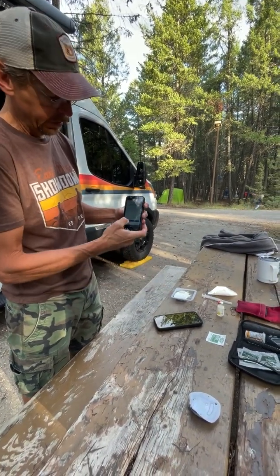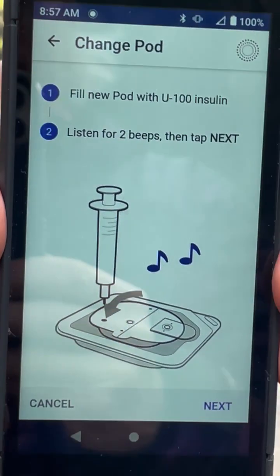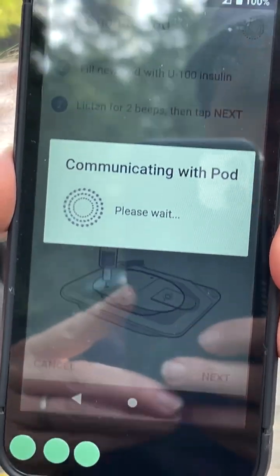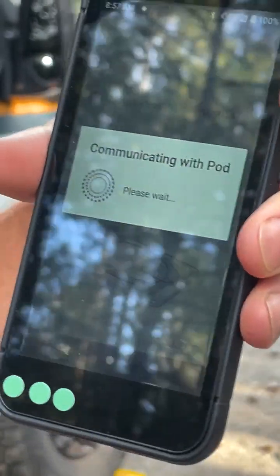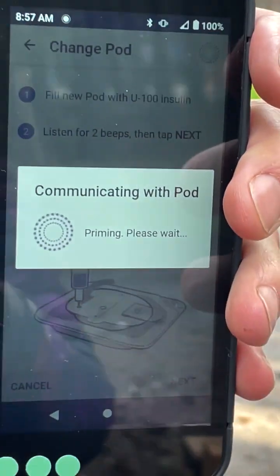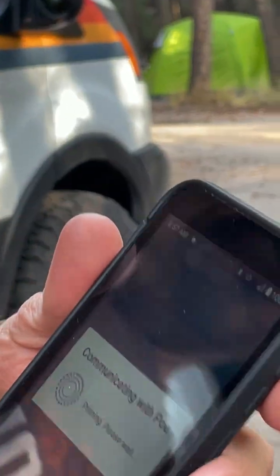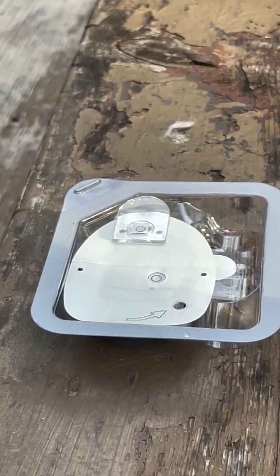The insulin's in the pod — set up pod. Now it's showing me to add the insulin in the pod, which I already did. Now it's priming the pod, and this will take a few minutes. One of the problems with this system is that the screen is not very bright — I have the brightness turned all the way up. When I'm out on a bike ride with my sunglasses on, I can't read this and I have to stop and take off my sunglasses. That can be an issue if I'm having a roller coaster day and I'm having to give myself insulin often.